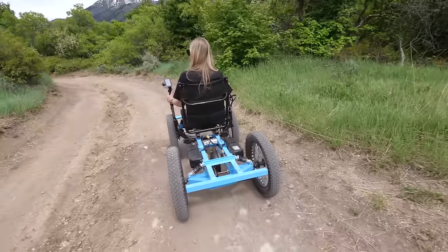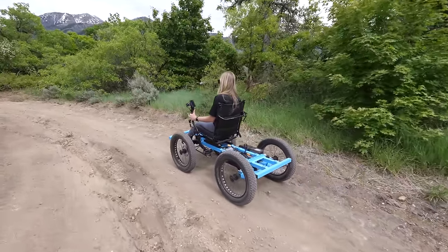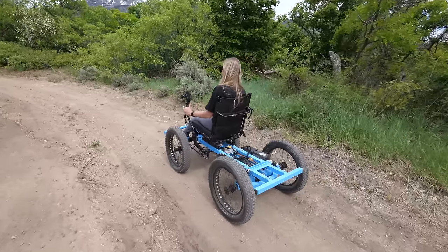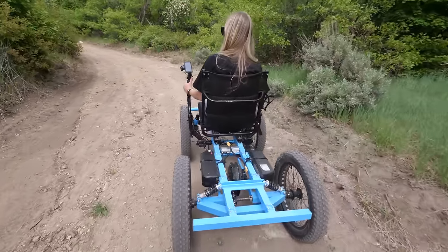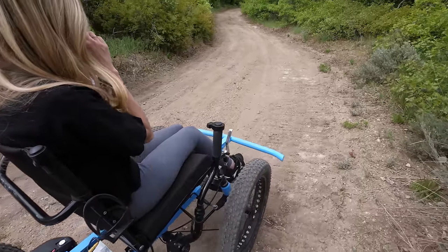The rig is mostly built from bike parts — from the rotors, calipers, hydraulic brake system, the e-bike motor, and the e-bike batteries. The version Cambry is riding right now has two batteries on the back. The batteries on the back determine how far the rig can go.